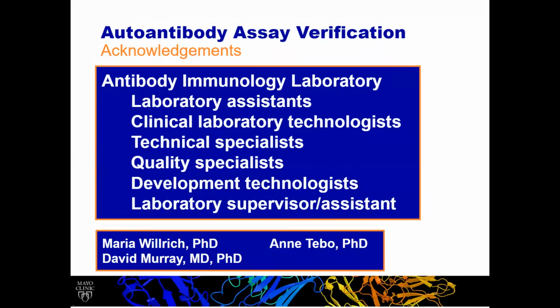Our first question, Dr. Snyder, how might a lab troubleshoot method discrepancies that are identified during verification? This is a good question, and I think one that anybody who does autoantibody testing will encounter at some point when they're doing verifications. And I would say there's just not a really easy answer. It so much depends on the specific autoantibody that you're doing a verification for. So probably the first thing that I would do when troubleshooting discrepancies is to bring in a third method, even a fourth method, and really get a more global view of the nature of discrepancies.